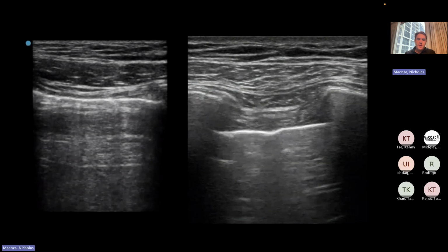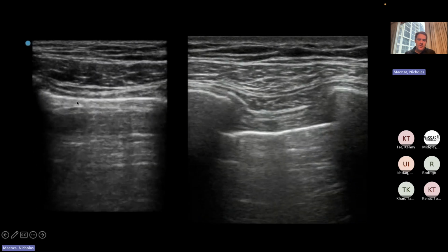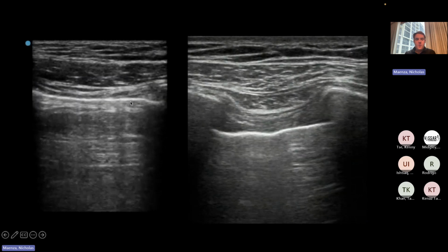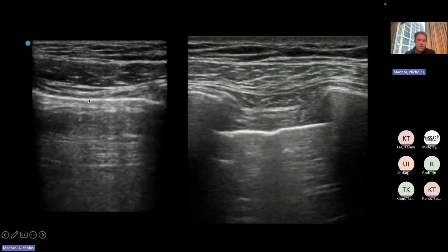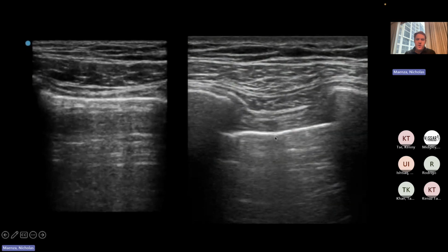And then just side by side. So here along this line, it's not as profound as the other one was. But if you look along this line, you see a little movement, this little shimmering along that line. And on this one, you don't see anything.